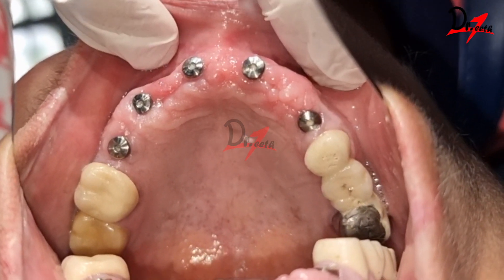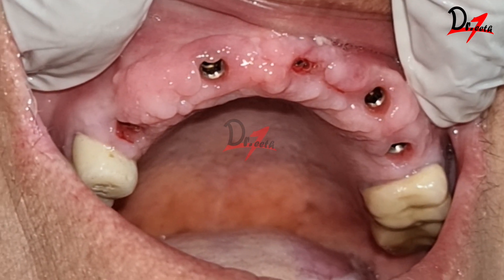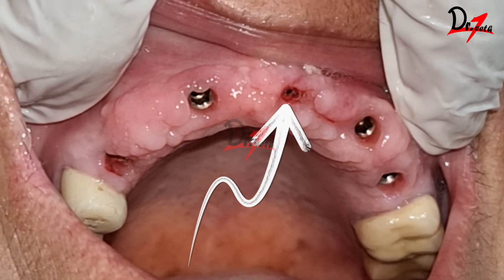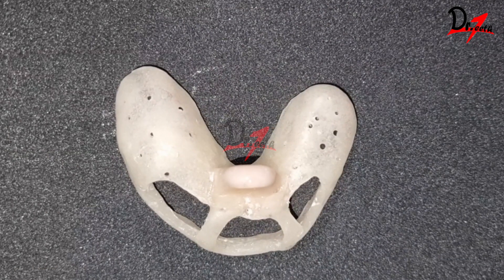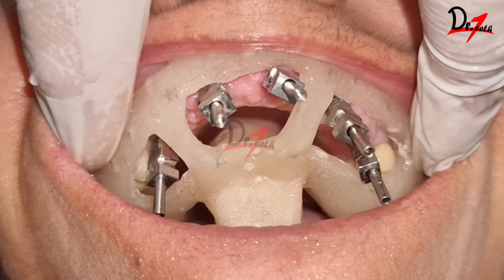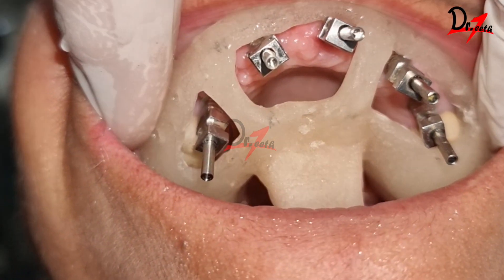Here we have the gingival formers that we are going to remove. As you can see, we have the gingival collar beautifully formed, and here you can see one of the implants is deep seated. We had already made the primary impression of this patient and we have made a custom tray for this patient. This custom tray will be tried after fixing the open tray impression coping and will be modified if needed.